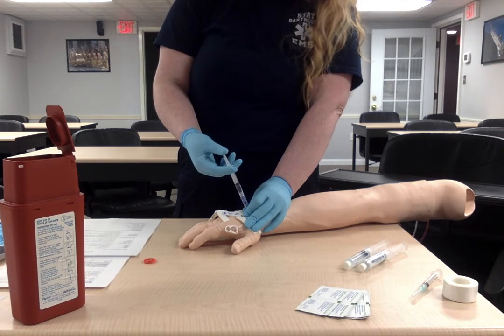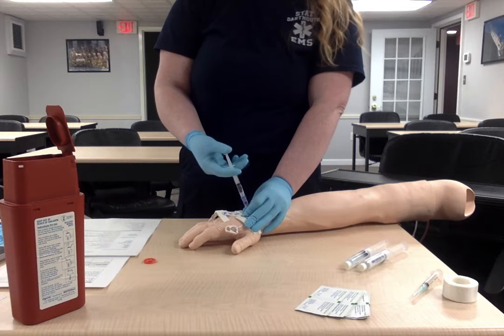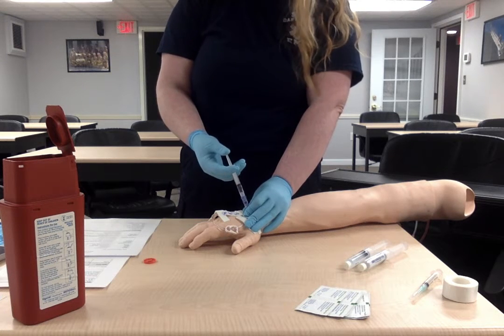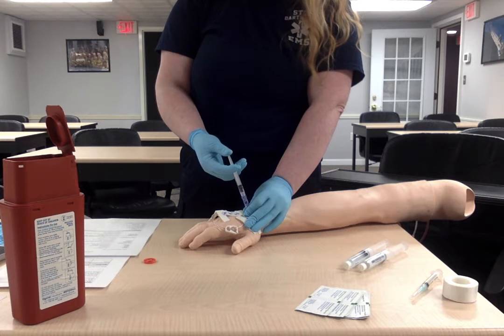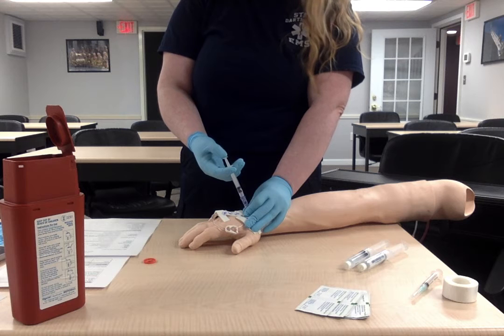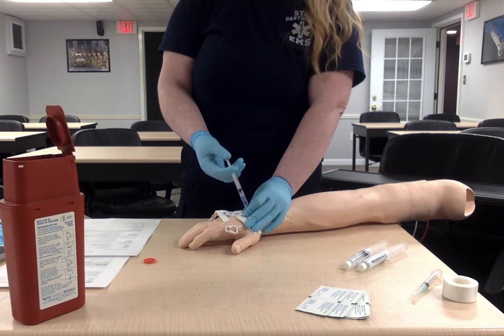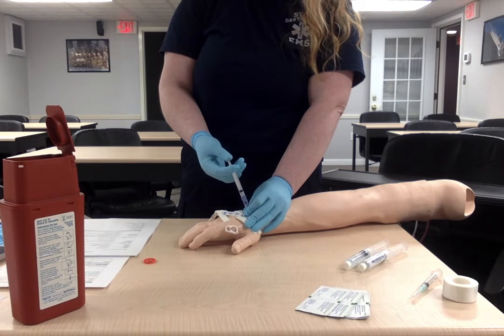So we're right about 30 seconds now, and we have about 1 ml in. There's no adverse reaction, so we're going to continue pushing. Remember, this goes right into the bloodstream, so we want to make sure that we're extra cautious to look for adverse reactions. And we're going to continue this until the entire dose is given over those 60 seconds. So again, 0.5 milligrams over 60 seconds, IV push.